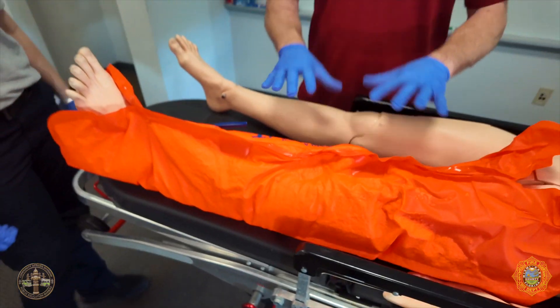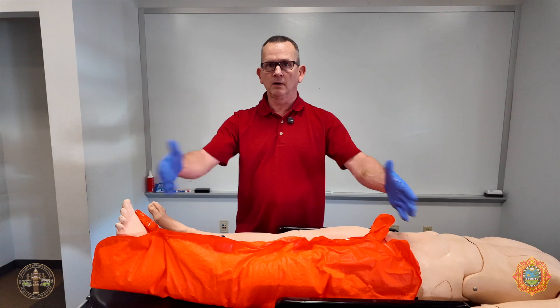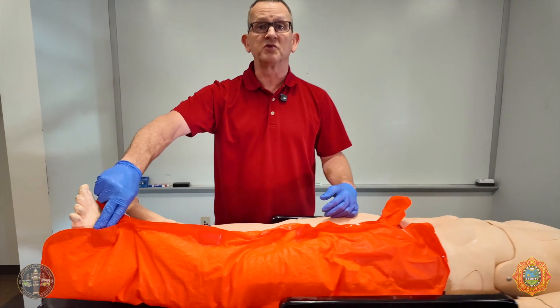You're going to let go now. This will not move. The leg is still contained in this device. And we would check for a pedal pulse one more time.